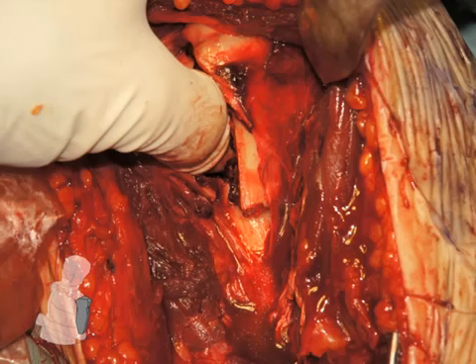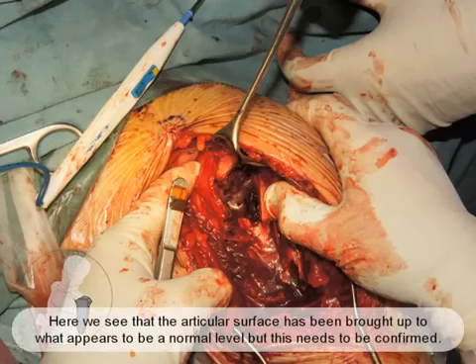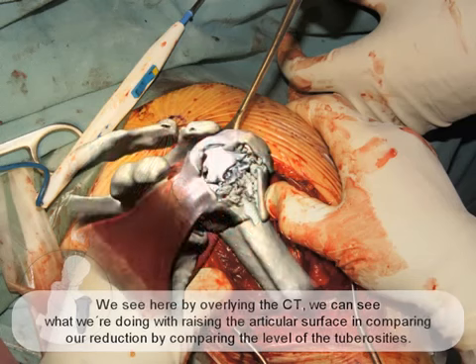Further reduction is made through the fracture fragments. Commonly the metaphyseal regions are reduced back in place, and the greater and lesser tuberosities are eventually mobilized back over the articular segment. Here we see that the articular surface has been brought up to what appears to be a normal level, but this needs to be confirmed by bringing your tuberosities back around to confirm the appropriate height has been obtained and maintained. We see here by overlaying a reconstruction of the CT what we're doing with raising the articular surface and comparing our reduction by comparing the level of the tuberosities.